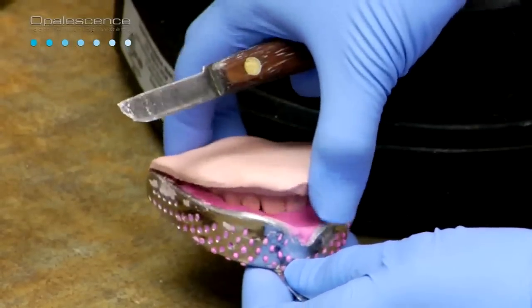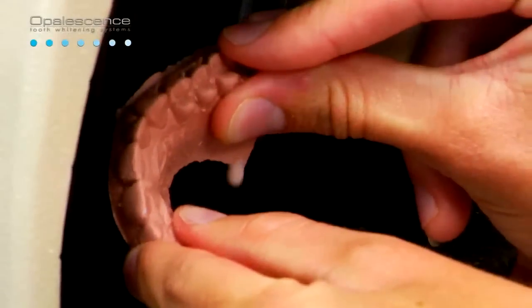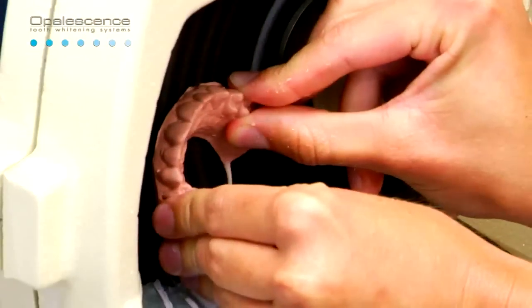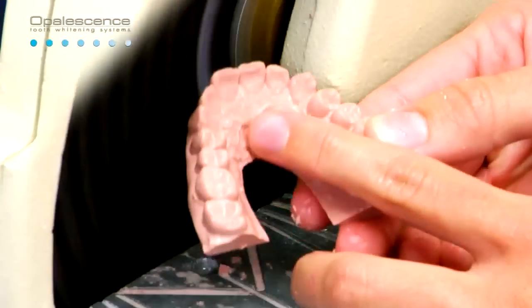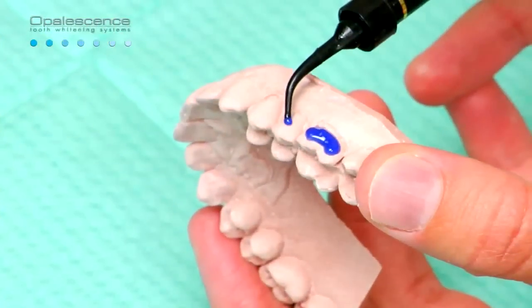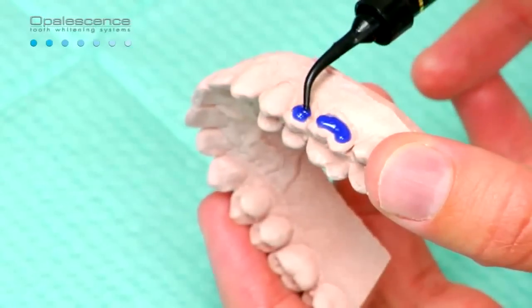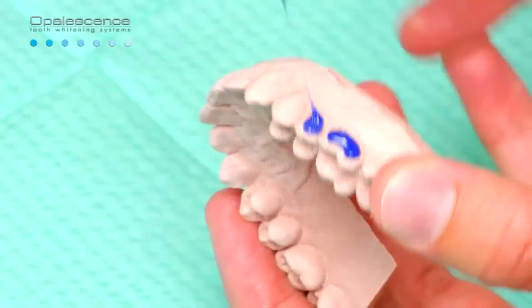When fabricating, remember to have enough mass to remove the model from the impression without breaking it. Trim the base of the cast parallel to the occlusal table plane on a model trimmer to within a few millimeters of the gingival margin for ease of manipulation. Note that the palate and tongue areas are removed. To create reservoir space on the model, apply approximately a 0.5 millimeter thickness of Ultradent LC block out resin onto the labial surfaces.